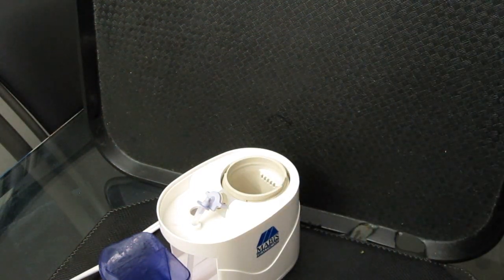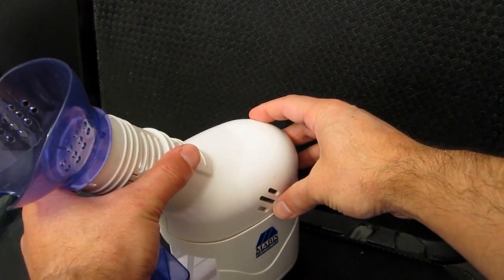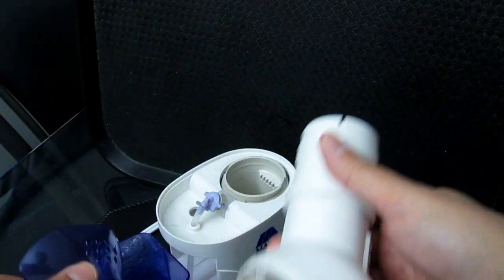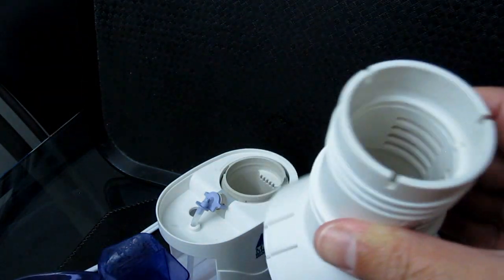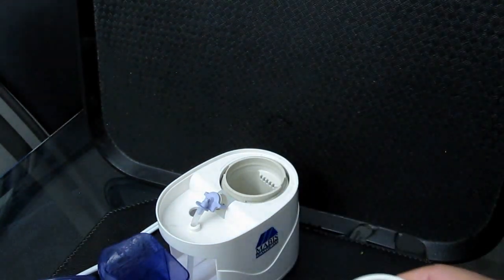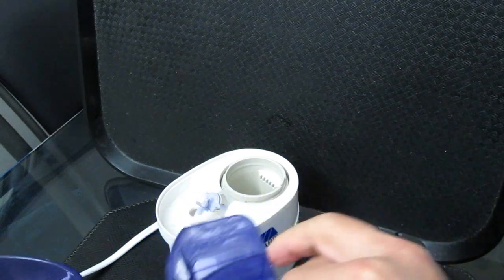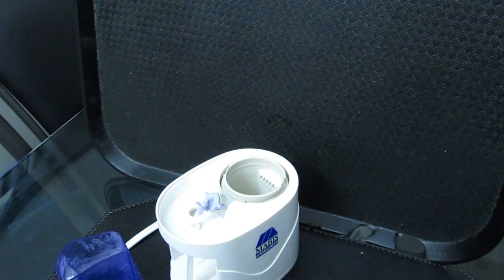And as far as the cleaning process, when I'm done, I take off the lid, take off the cover, take off this piece, and I essentially just wash everything out. Not so much this every time, this maybe every 10 times, because it's just steam going through there. You don't have to wash this unit, but the essential oils, you give that a good rinse, and this, because this has your mouth on it. And that's why the cleanup is simple. The whole thing is a lot easier than the whole bowl trick. Anyway, let's give this a go.